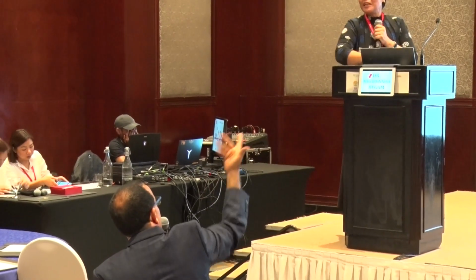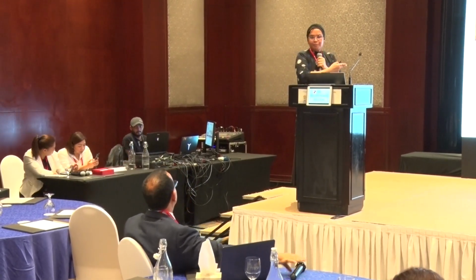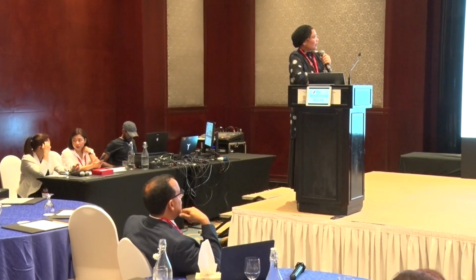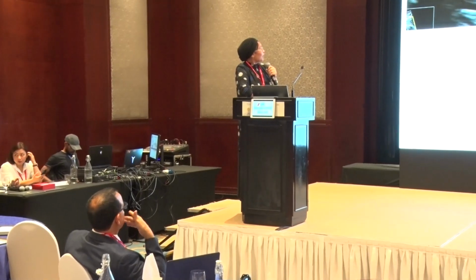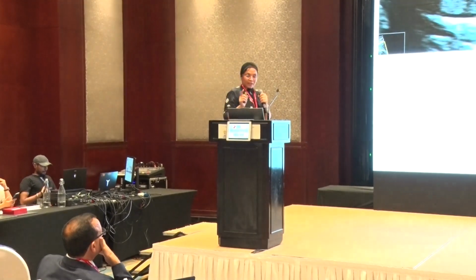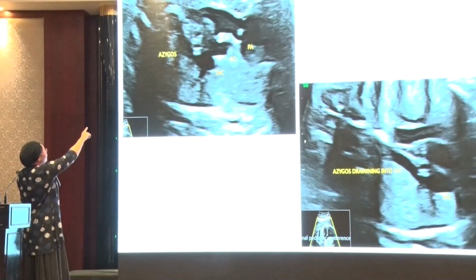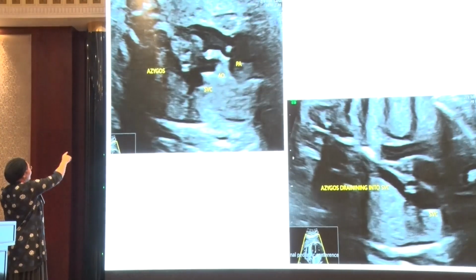True. Unfortunately, I did all the package what Suleiman is saying. That's the reason. The point I'm bringing here is that sometimes you will see only one venous abnormality with the rest of the heart being normal. Let me go through so we can understand that. So the aorta and the RVOT were both normal. And again, with the live images, it will be very nice. What we can see in the three-vessel view, you have the pulmonary artery, aorta, and SVC.